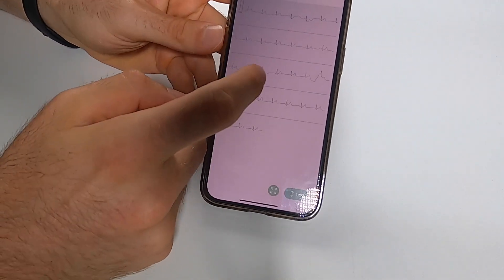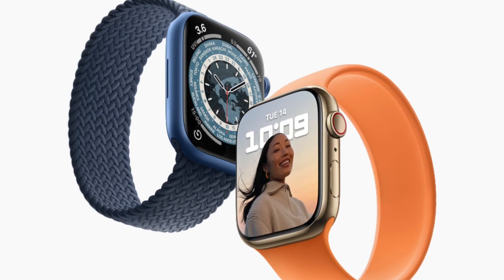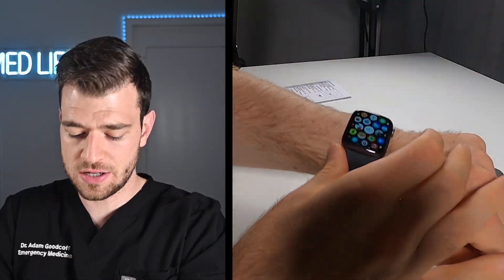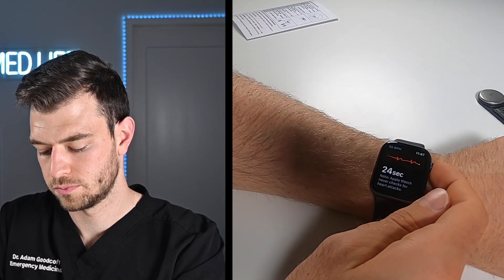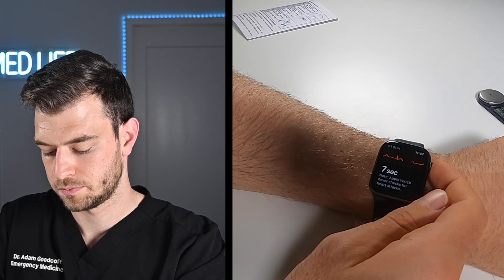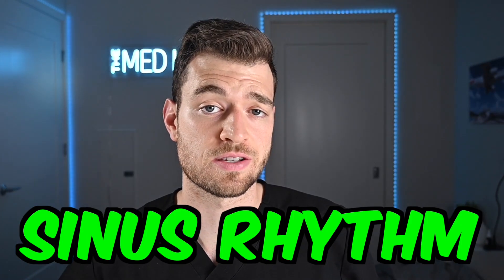You can see that this actually did a pretty good job and it's a pretty clean strip. Overall though, I think we should compare that to the Apple Watch — what better way than to just pull out my watch and start an EKG. Just like that, Apple is going to say sinus rhythm.